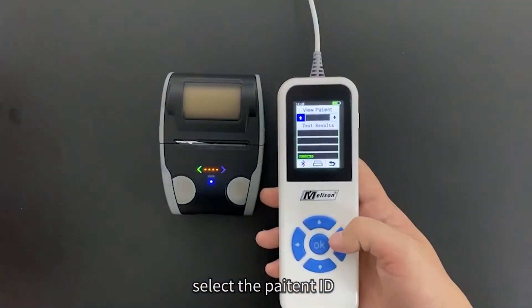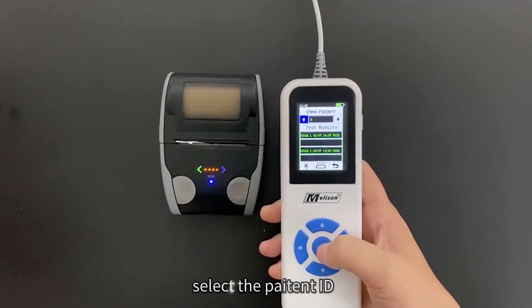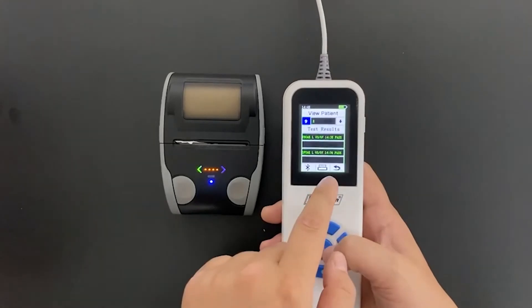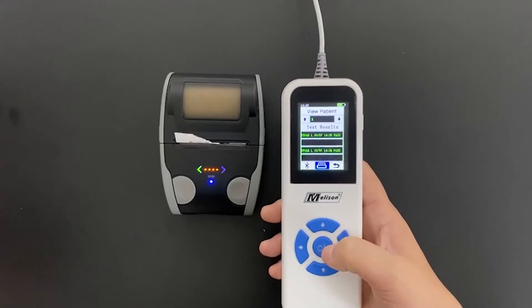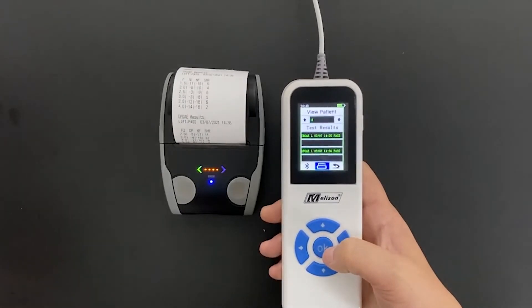Select the patient ID, then select print. Thank you.